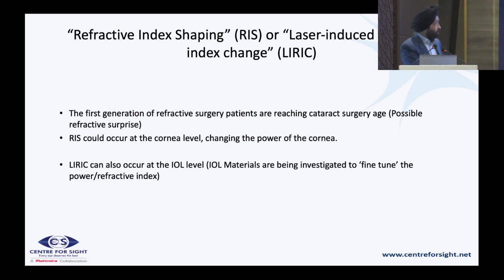The other thing that is being worked upon is called LIRIC, that is laser induced refractive index change. And this laser induced refractive index change, without making perforations, can be either on the cornea or on future intraocular lenses that are being manufactured.